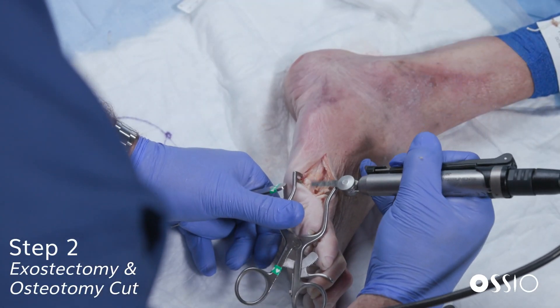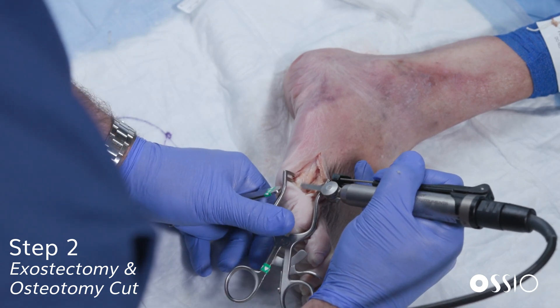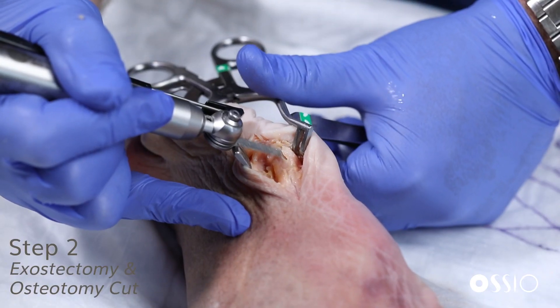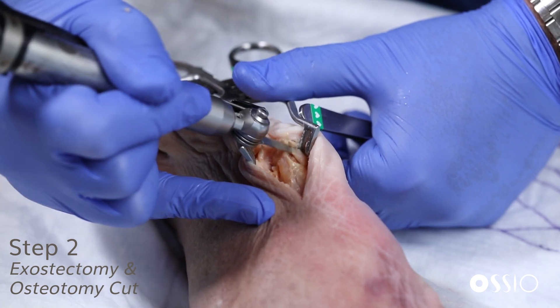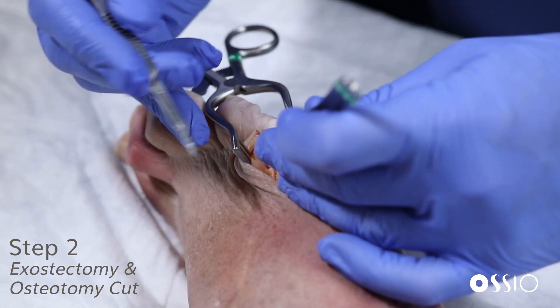A sagittal saw is used to resect any hypertrophic bone laterally — the exostosis. Sometimes there will be some associated bursitis that will need to be addressed as well. This exostectomy is done fairly perpendicular to the long axis of the bone, just flattening off the side of the metatarsal head.